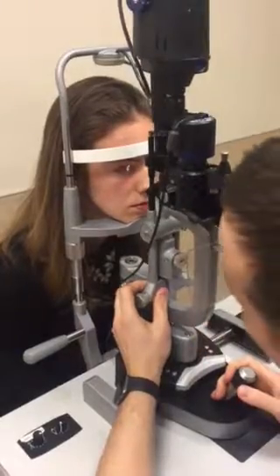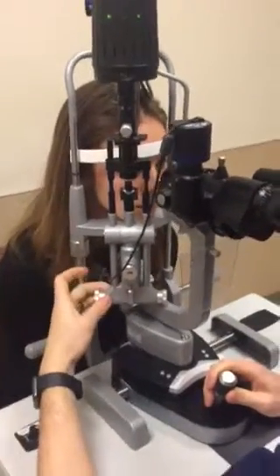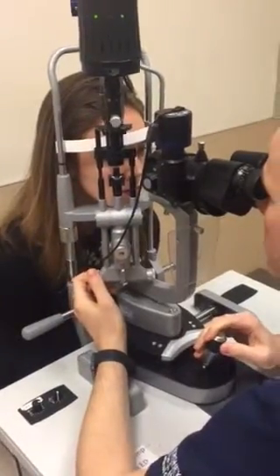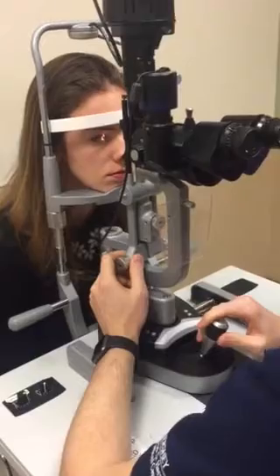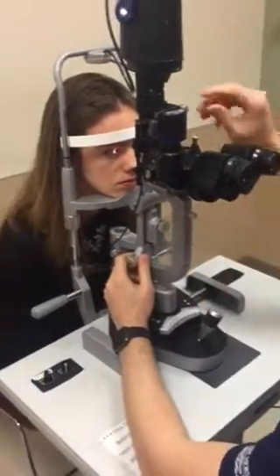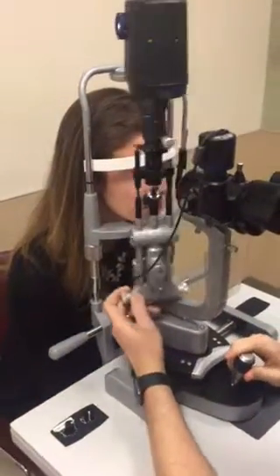Now we're going to look at the cornea. For this, you can scan with the white light — I'm temporal, so my slit lamp angle is coming in at a 45-degree angle. Scan that; once I cross the midline, I move the slit lamp adjustment to the right and look at the other side. Here is where you want to use blue light — turn the room dark, turn one click to the left for blue light, and now we're scanning with blue light, looking for any abrasions, ulcerations, keratitis, or anything affecting the cornea. Switch back to white light with one click to the right.